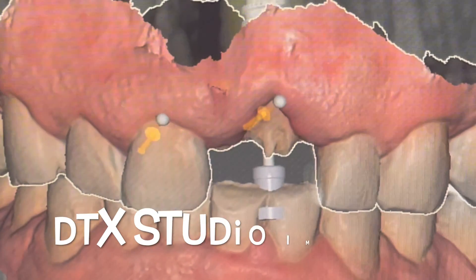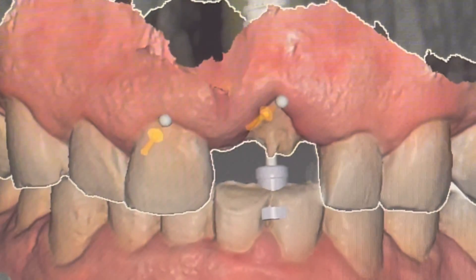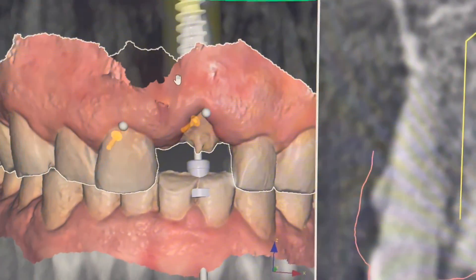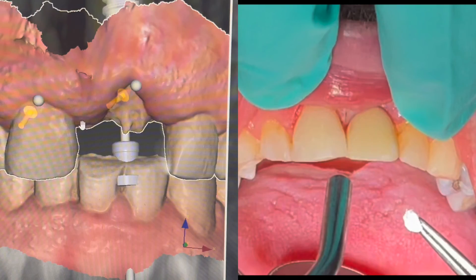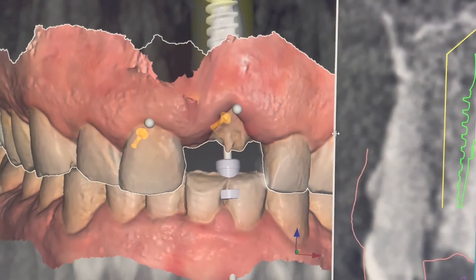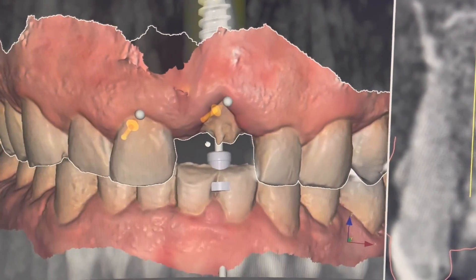Looking at the DTX Studio Plan, which is the software from Nobel BioCare, we can see that there's a problem with the emergence profile of the 2-1 and the 1-1 — or teeth 8 and 9 in the US. You can see where we got the case at the end, and I'll show you a little bit about how the prosthetics work, because this N1 Nobel BioCare implant is usually performing very well at creating soft tissue and holding the tissue.